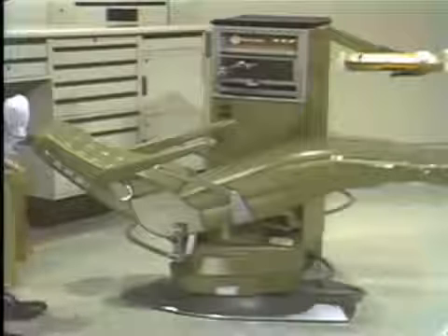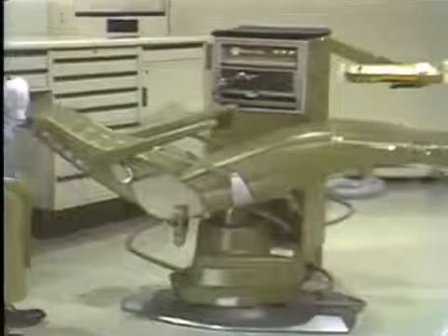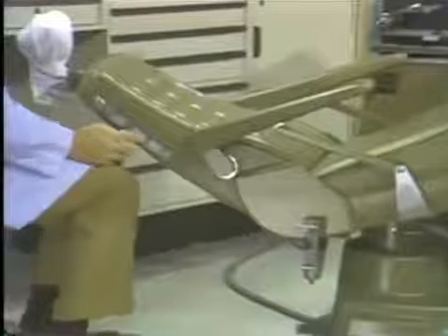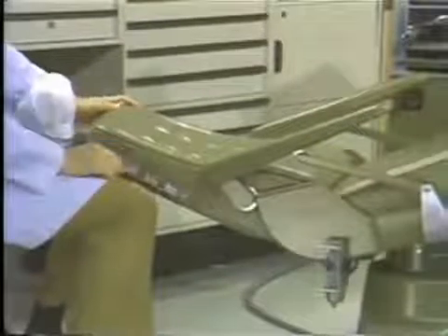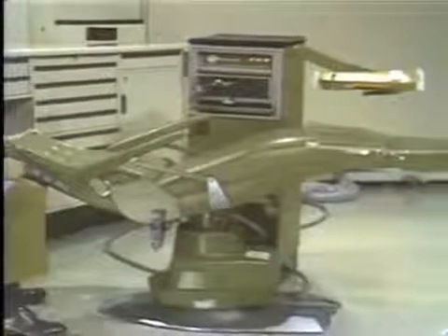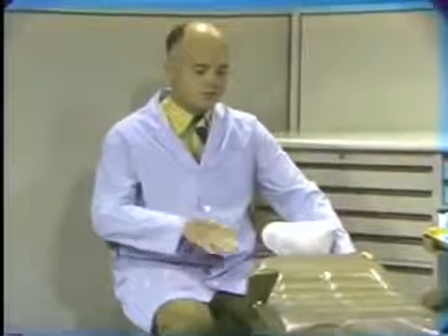Now for the maxillary quadrant, the chair will be raised sufficiently high so that the operator can get his knees in behind the back, and the back is dropped to about the plus 10-degree mark. We would prefer that you do not use the horizontal or minus 10-degree mark, as this is going to lower the patient's head below the feet level and increase blood pressure to the head. Most patients object to this after a period of time and would much prefer the slightly raised position of the back at about the plus 10 or plus 15 degrees.